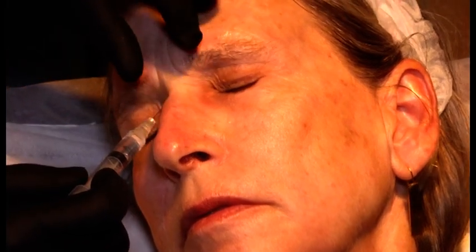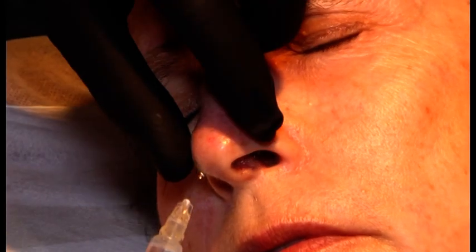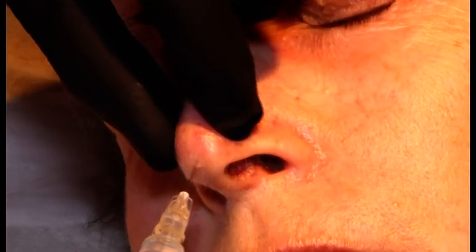and little swab. Please lean back. And I'll show you the easy technique. The easy technique, you start at the dorsal hump. 1, 2, 3. Little bit of anesthesia. And you start for the second one on the nasal tip. 1, 2, 3. And that's a bit painful.